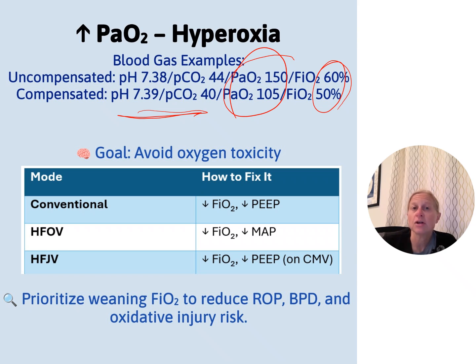And we often are also looking at the wiggle to make sure that the wiggle kind of matches the baby, and that's where our servo pressures end up. So as your baby gets more compliance, you might be changing your servo pressures, which could be reflected in a hyperoxia situation. But just something I wanted to mention, because you may notice we don't talk about that rate very often when we're talking about our jet.